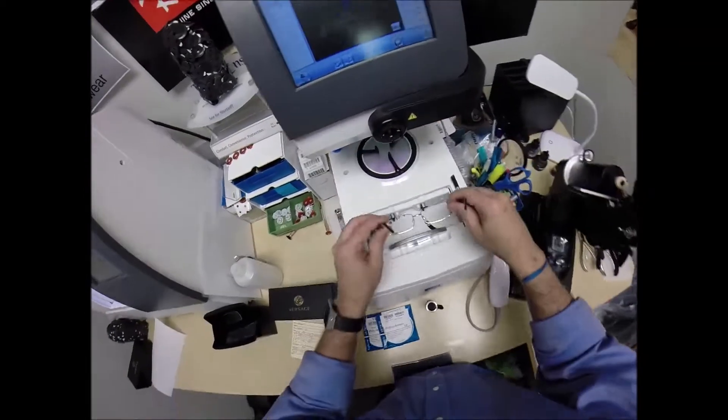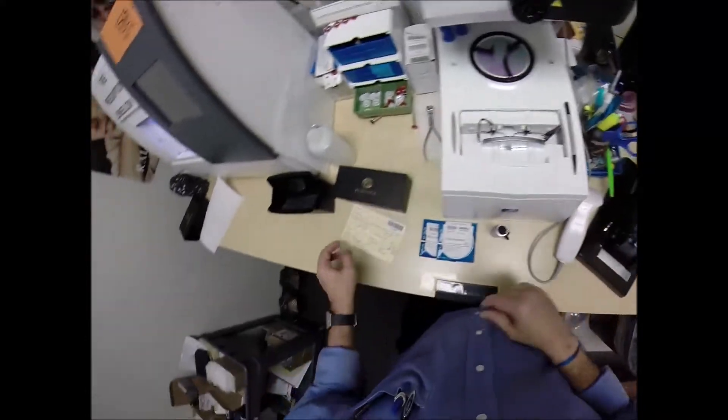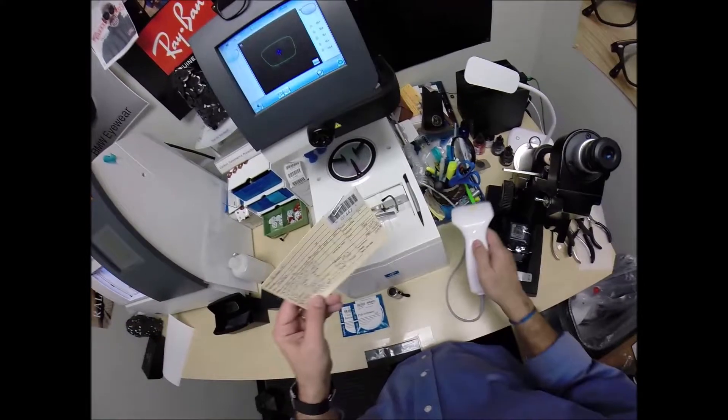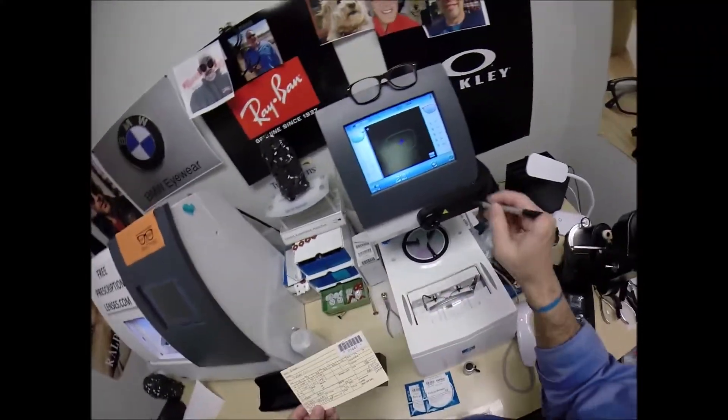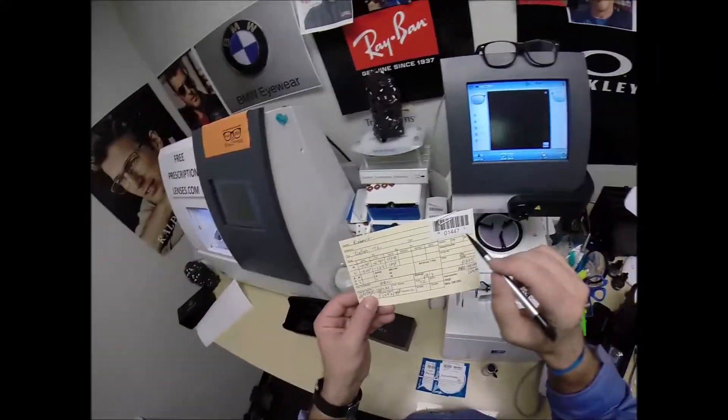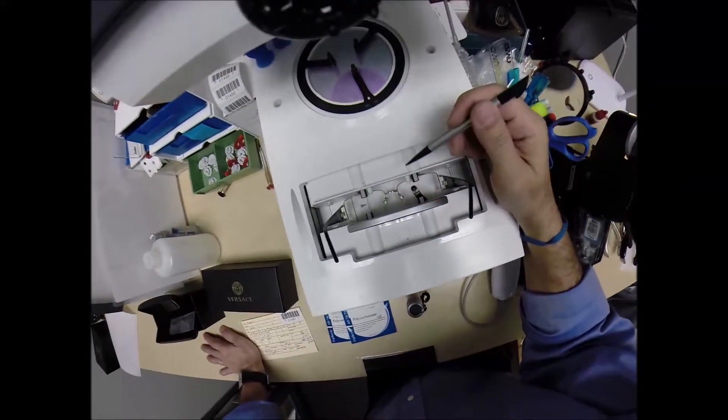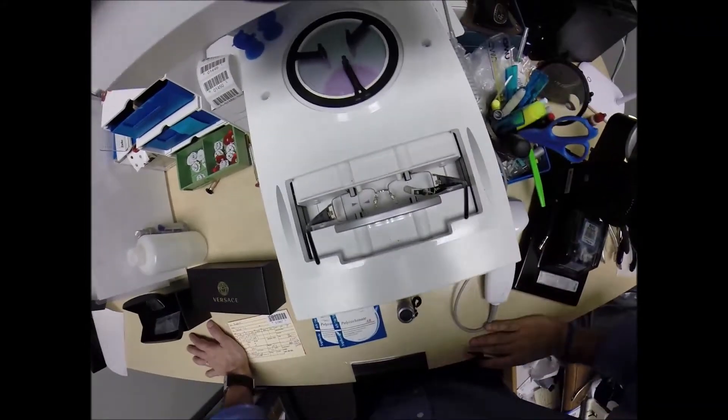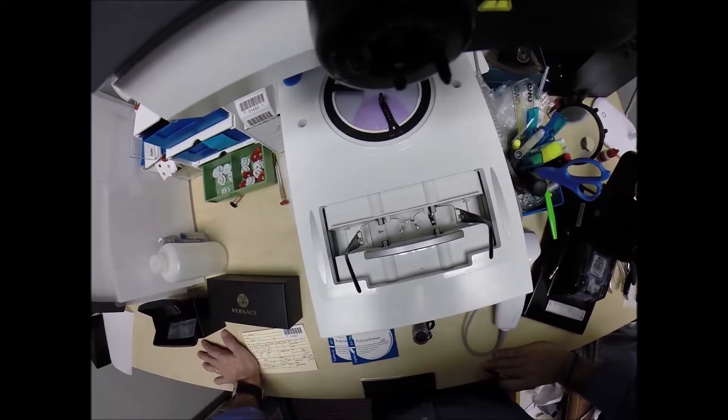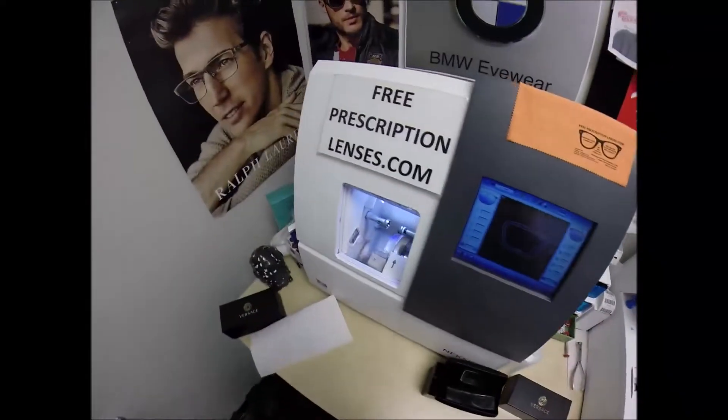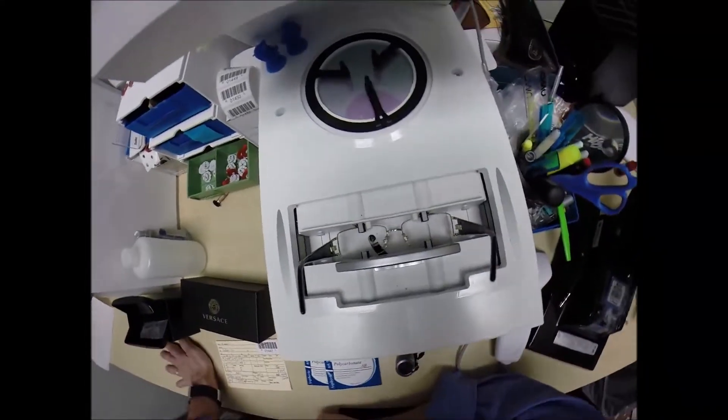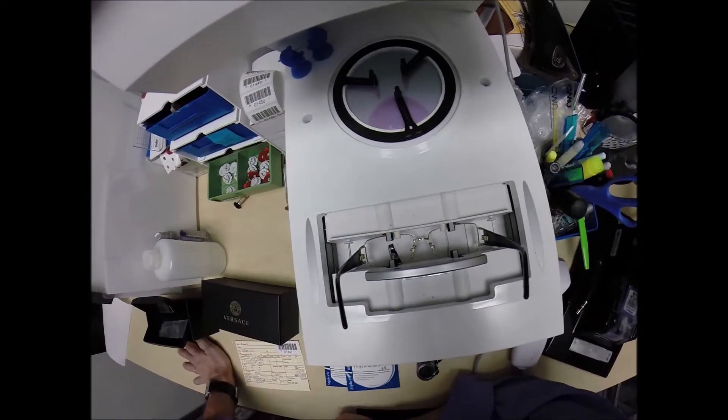So I'm going to put your frame into the tracing element of my blocker. And before I hit start, I'm going to program this shape into the computer, 1447. So years from now, should you ever need new lenses, they're programmed into the computer. And I can mail you just the lenses right to your home. And I'm going to show you how you can change them out years from now.